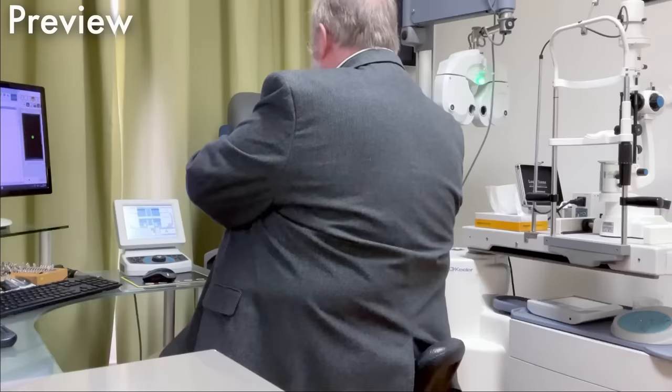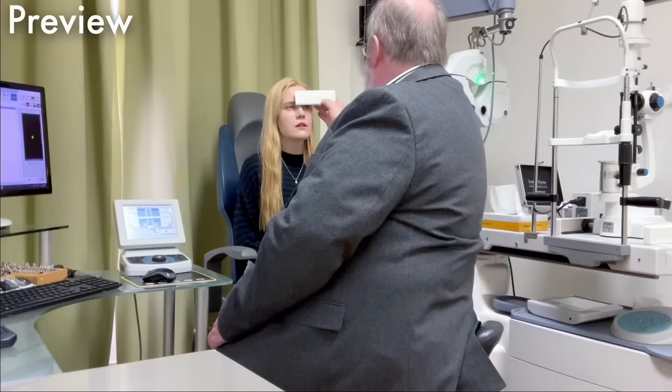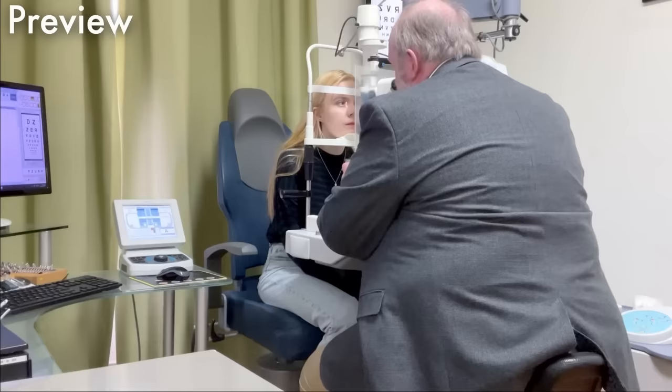Just look into my open eye for me. That's it, that one, that one. Back again. Back once more. And again, any better with one or with two? One, yeah. One's a bit better, yeah? Yeah, one's much better. Okay, just going to have a look at the outside of your eyes first.